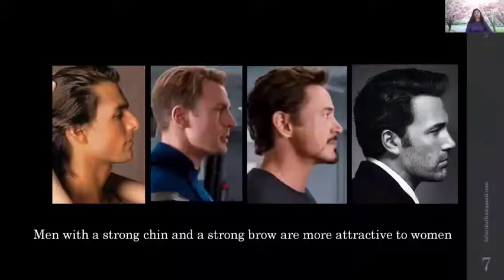using the twin block. And twin block is a miraculous appliance which can bring about changes in the mandible, which can help to grow the mandible in such a manner that you would feel nothing less than a miracle when a child with a growing status along with a weak mandible comes to you and you develop it with these muscle forces. You feel that it is nothing less than a miraculous appliance.